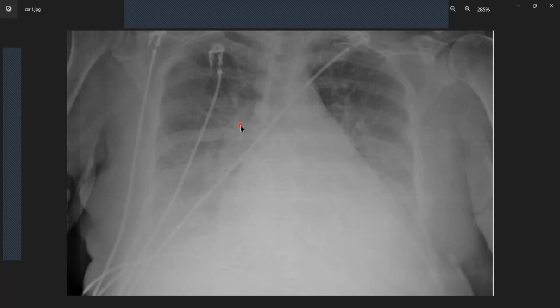It may just be an error. But anyway, in looking at the trachea, this actually gives you a good idea of what's going on, especially when you've got whited out lungs. Now, even though the superior areas are not whited out, the inferior areas are. There's two possible explanations besides pulmonary congestion that can give you this. One, of course, is a pleural effusion, and the other one is atelectasis, or lung collapse.